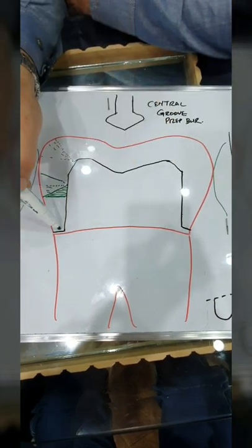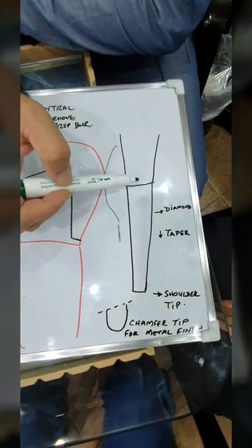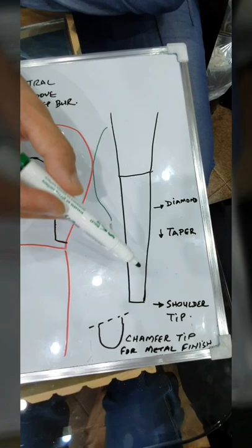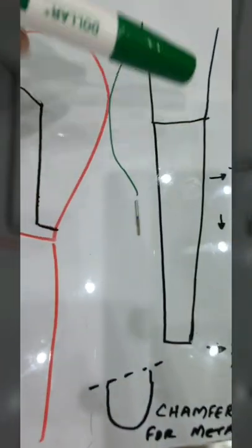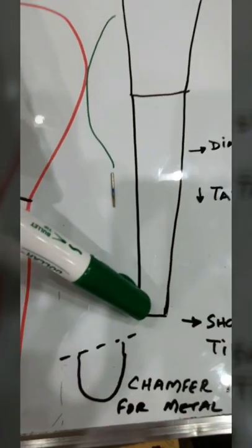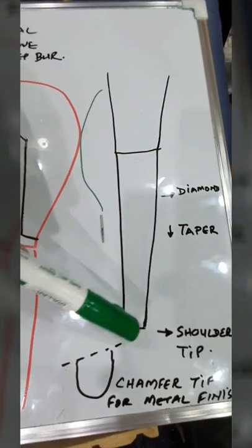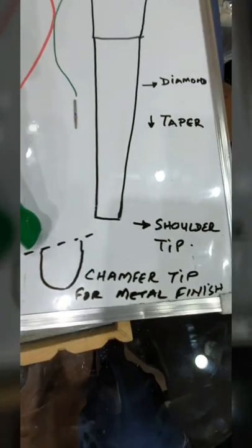In order to get this inside form, we need to use a burr that matches the shape. So we have selected a shoulder prep or shoulder tip type of burr. The parts of the burr: you would have a shank up there, right here, and then you would have the diamond coated tip, and the tip of it would look something like such. This is the exaggerated, blown-up view of the tip. Compare that to a chamfer tip. Chamfer tips are normally rounded.